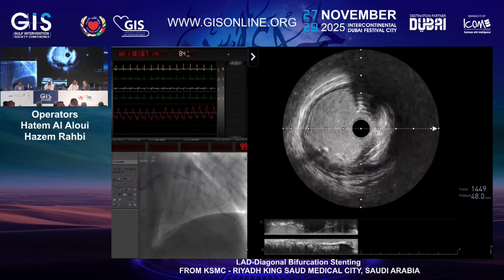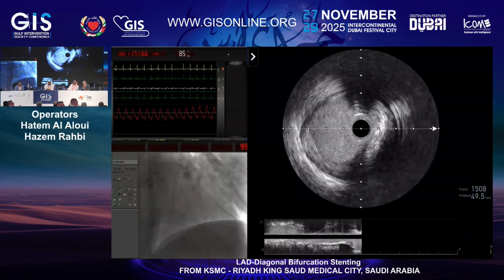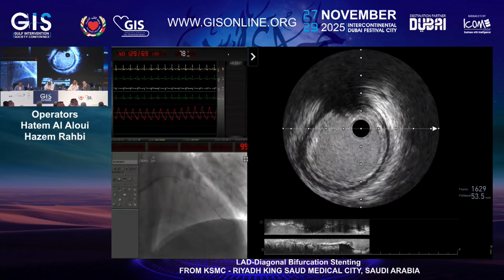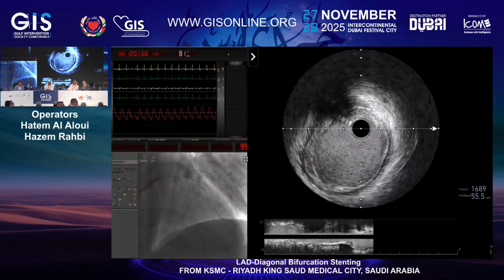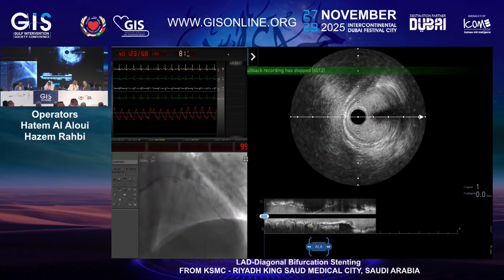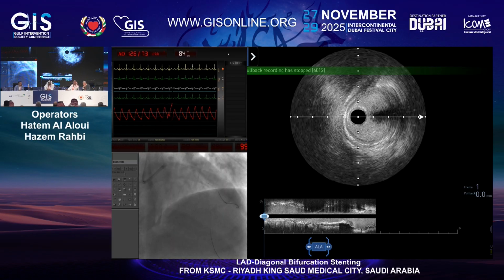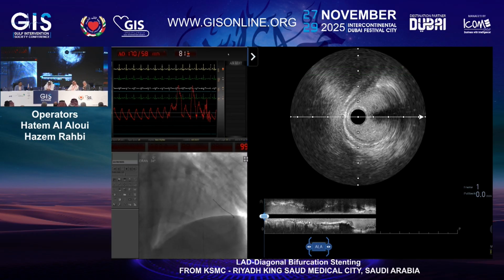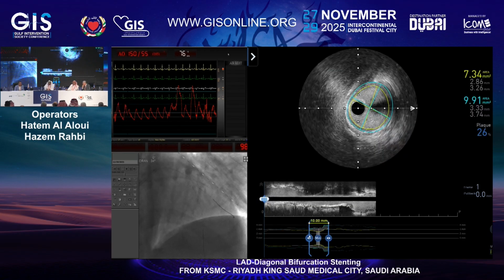It's a nasty lesion. If we were doing an OCT, it could probably be a TCFA, but we won't touch it, I think. Yes, the stent looks well apposed. As you said, there is disease in the proximal LAD, but it's not significant.